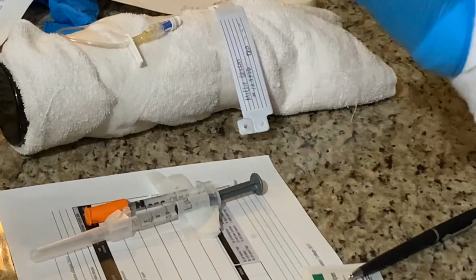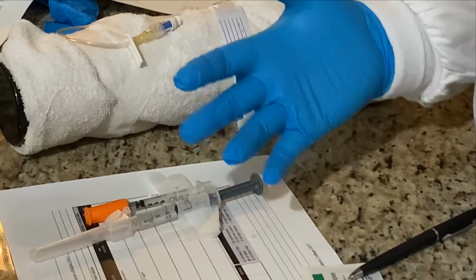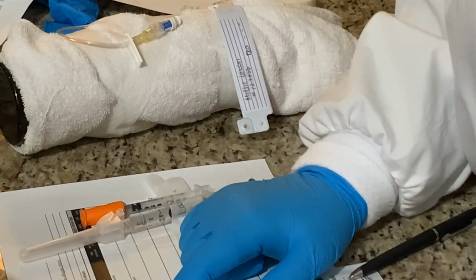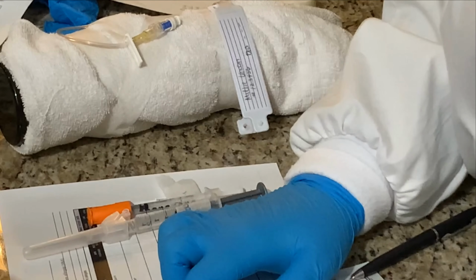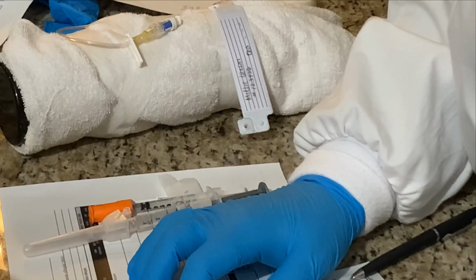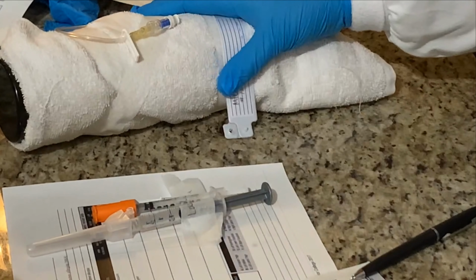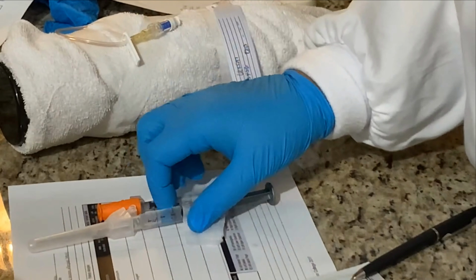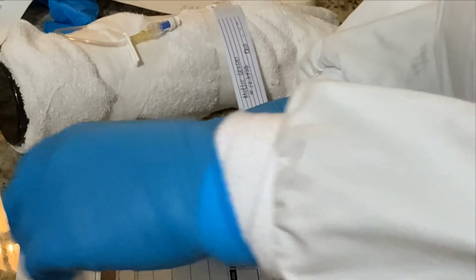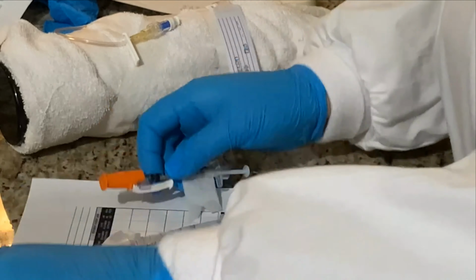I've done 3 checks. And I'm making sure that I've done my 7 rights. Anytime that you're giving medications, you want to make sure you've done your 7 rights, that you have the right time, which this is ordered now. You have the right route. We've talked about its IV push and sub-Q. The indication, we talked about how it's for heart failure and her diabetes. And then, of course, I've identified my patient, the right patient. I've identified the drug, the dose. I have got my furosemide, 20 milligrams, and I've got my Lispro, 10 units.